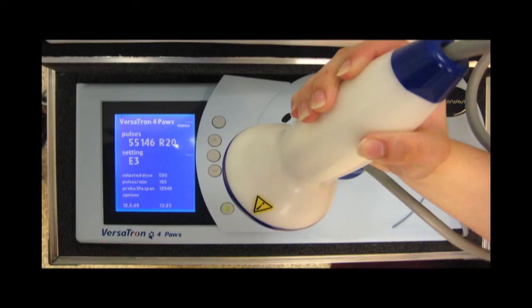This is a demonstration of the Versatron, a device that generates high-energy acoustic waves to stimulate healing at a cellular level. Here we see in the picture the device with the head of the device, also called the trode.